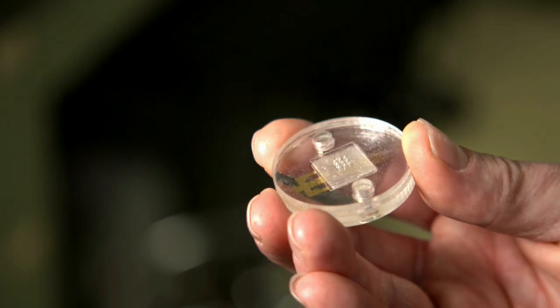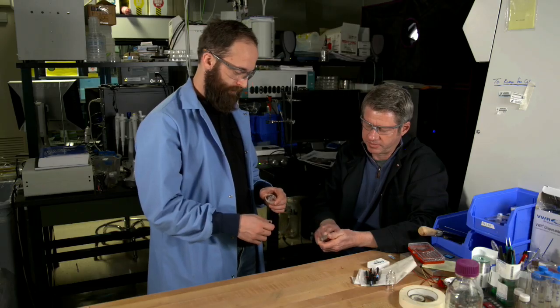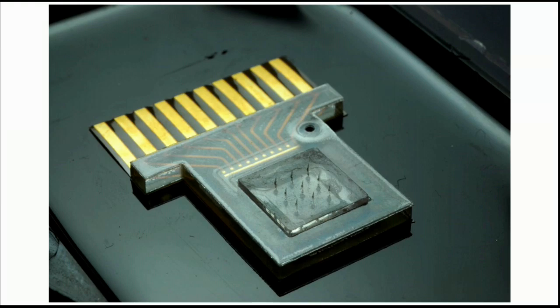Researchers at Sandia National Labs have created an integrated microneedle sensor called the Transdermal Health Monitor. An array of these microneedles can be placed on a single substrate, where each individual needle can monitor a certain type of biomarker.